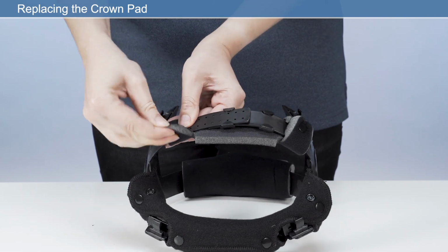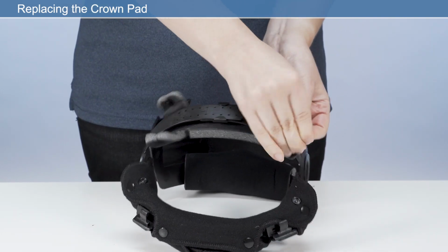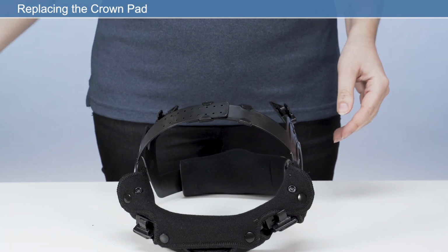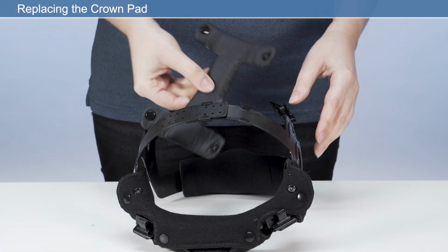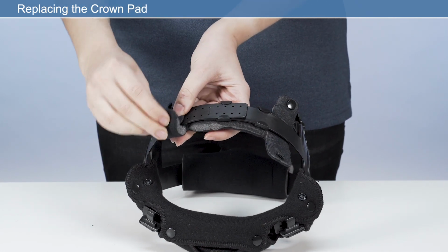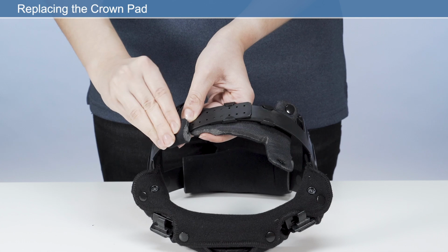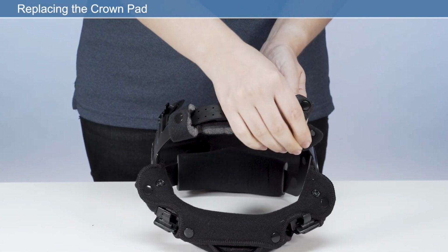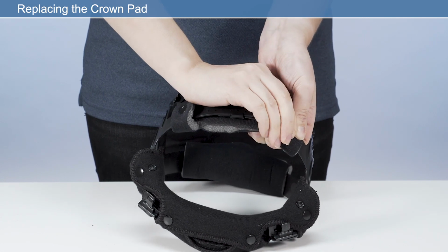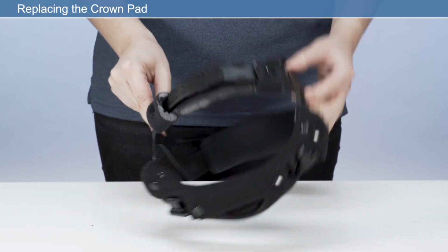Replacing the crown pad. Detach the press fasteners from the crown comfort pad and remove from the headband. Wrap the new crown pad around the crown section of headband and secure the press fasteners. Ensure the perforated side of the crown pad is facing the user's skin. To assist with changing the crown pad, it may be necessary to remove the headband.